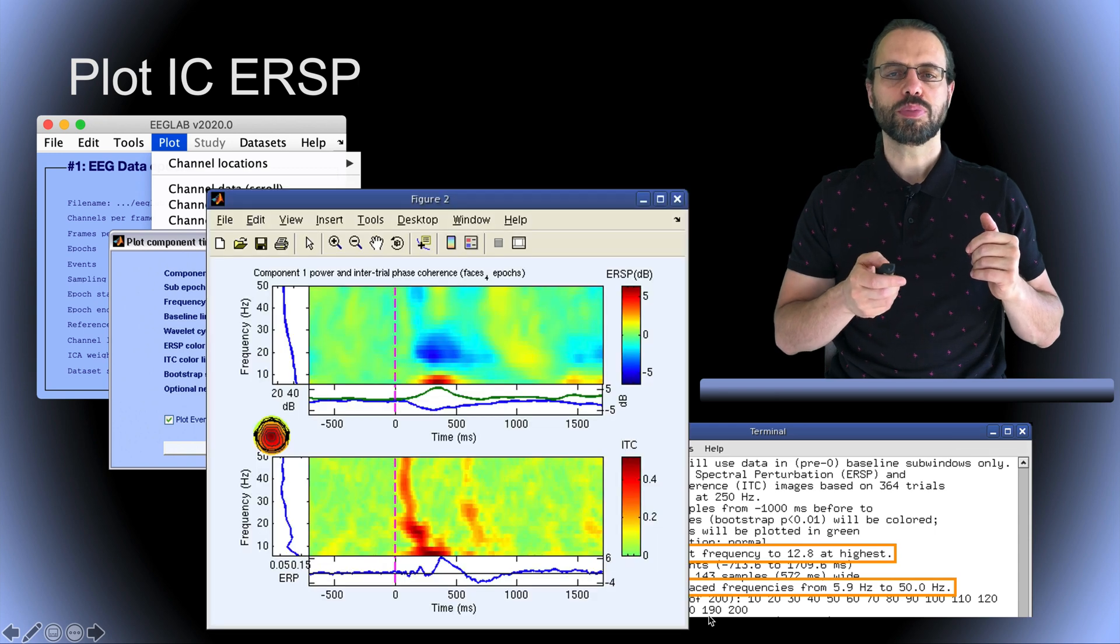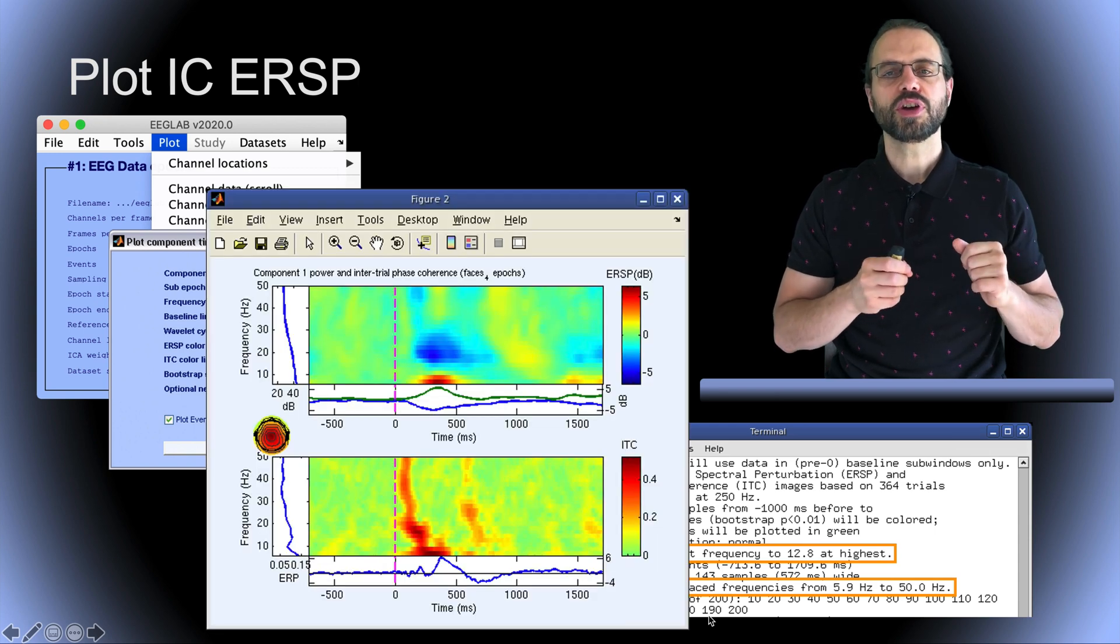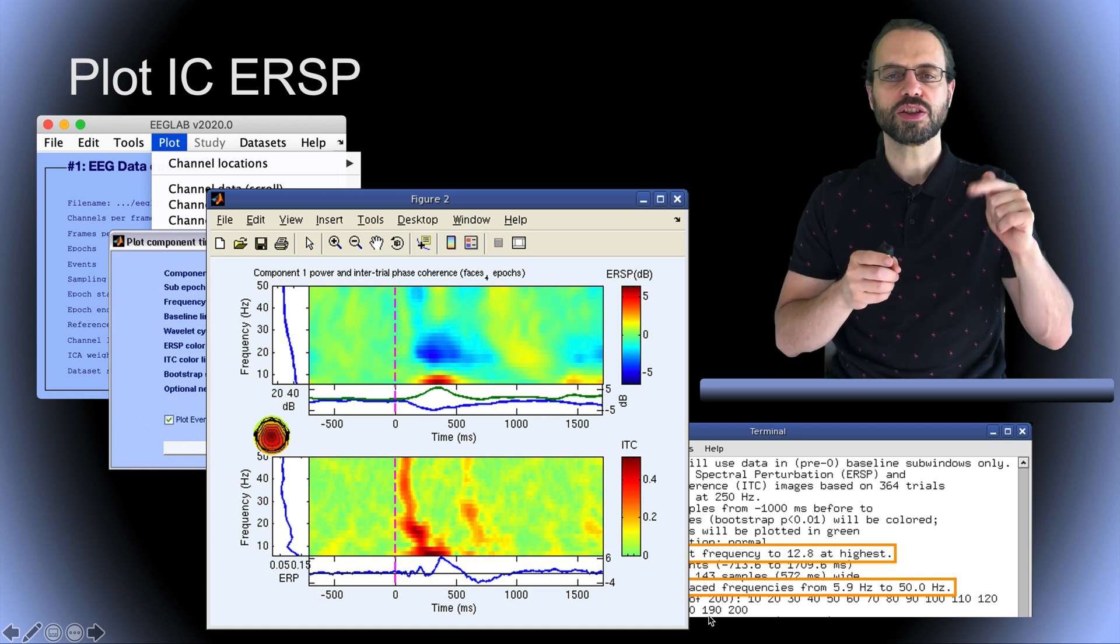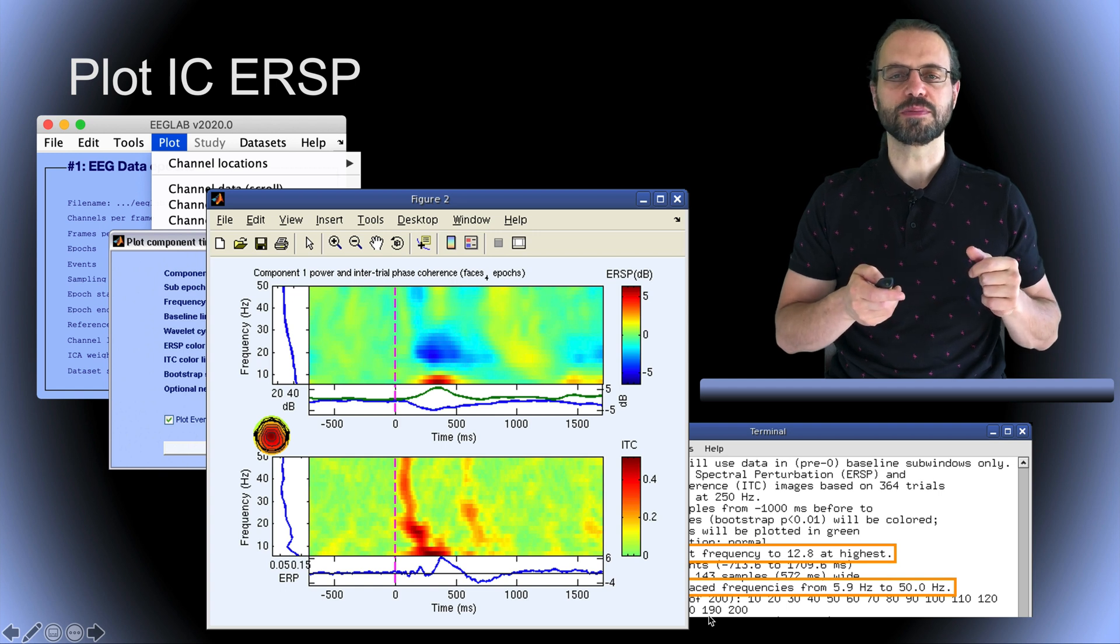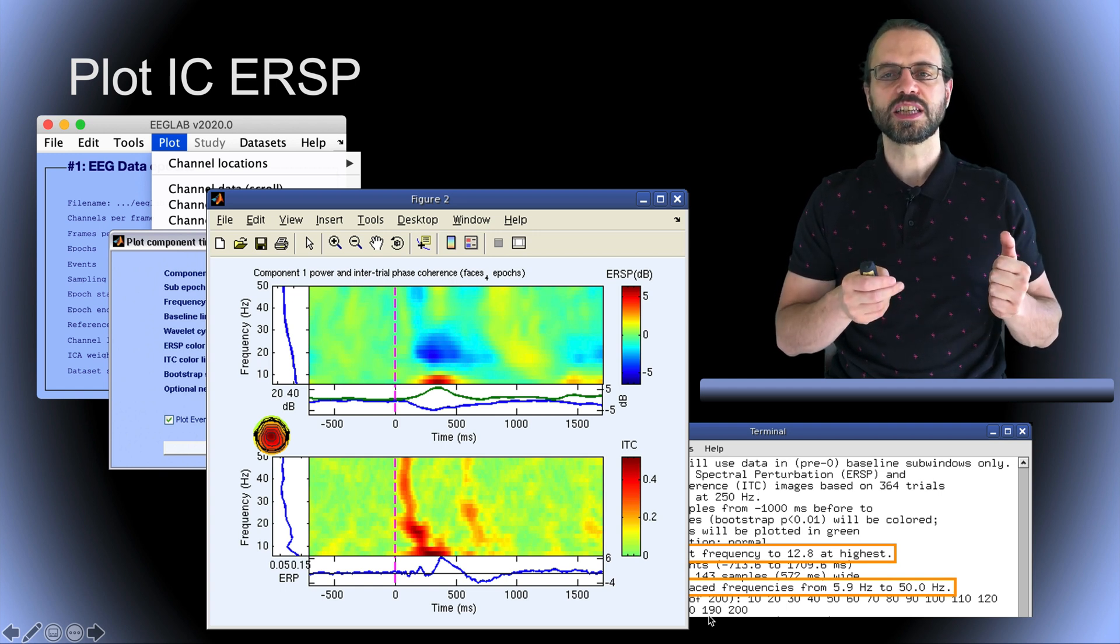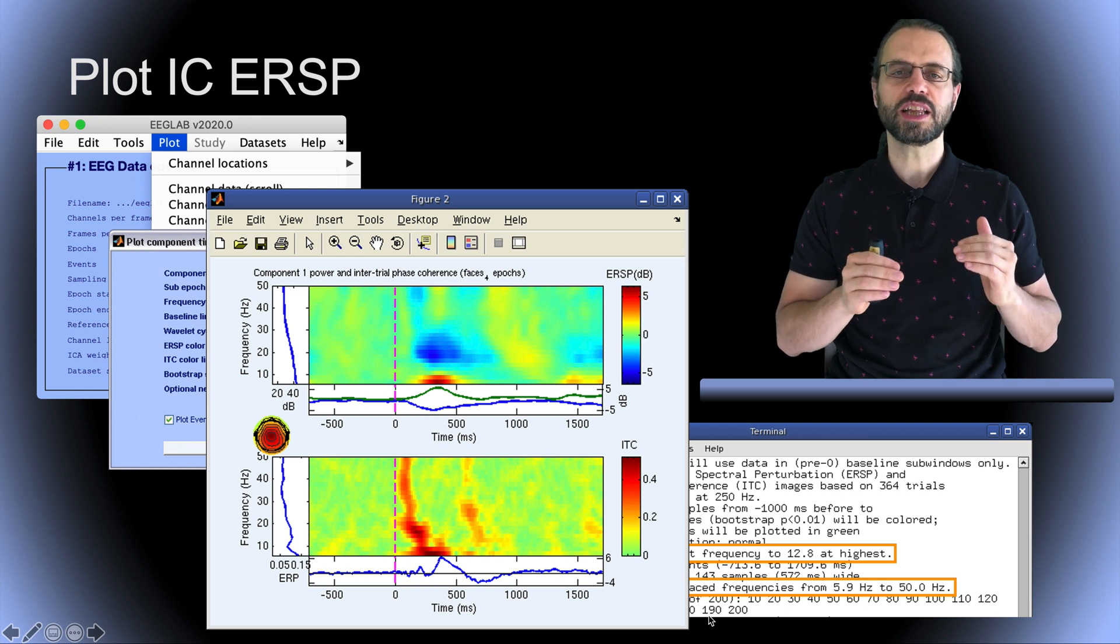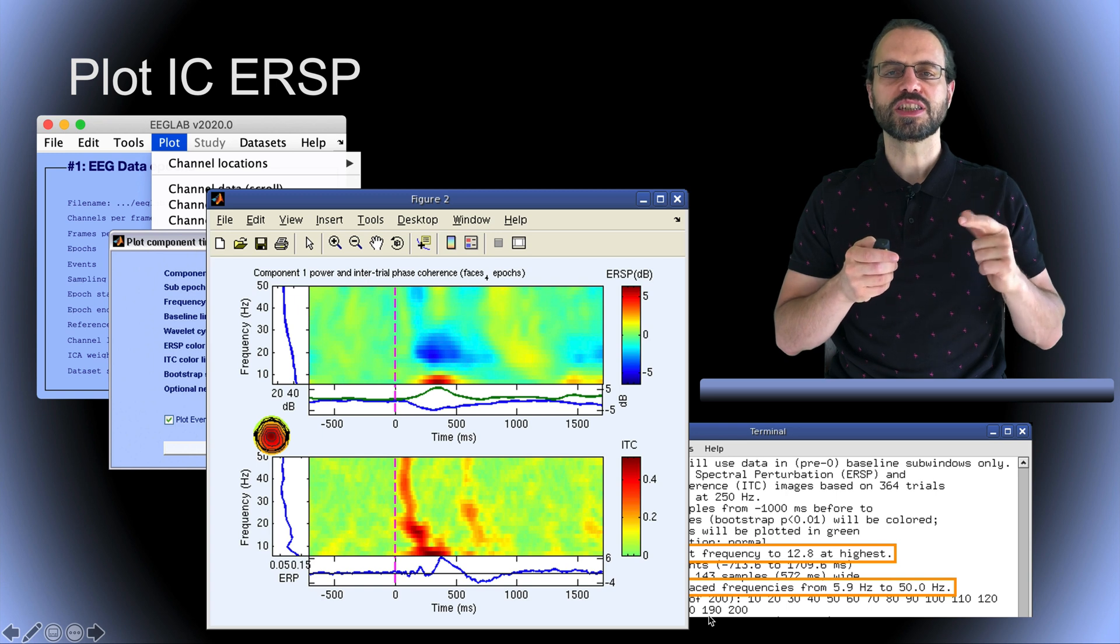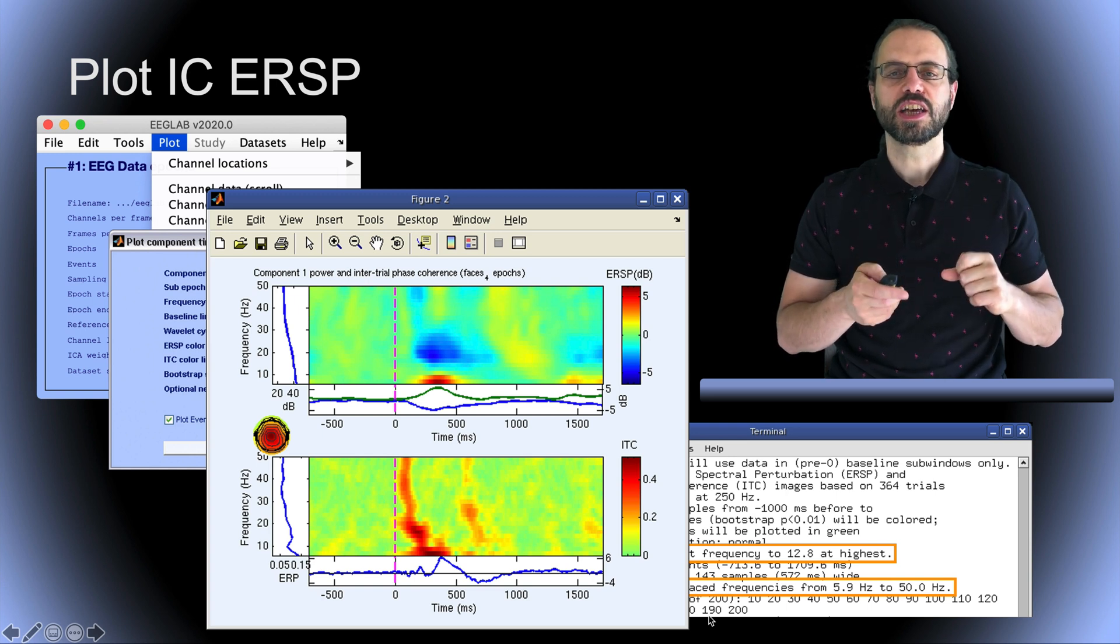This is the plot you obtain. On the top, you have the event-related spectral perturbation or ERSP and on the bottom, you have the intertrial coherence or ITC. In this component, we can see blocking of 20 Hz frequency band activity after stimulus presentation and increase in 5 to 8 Hz frequency band activity.